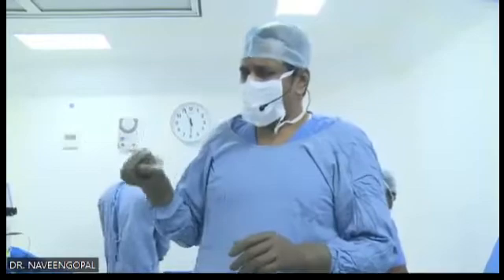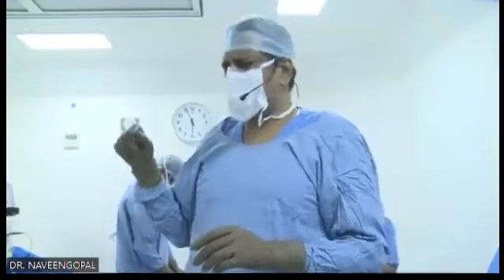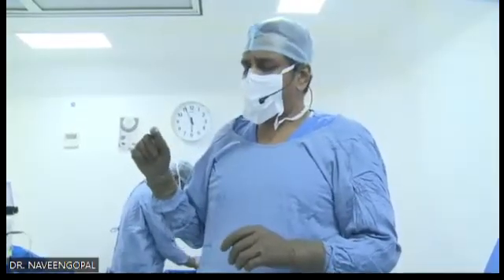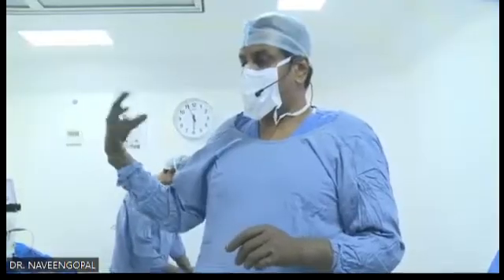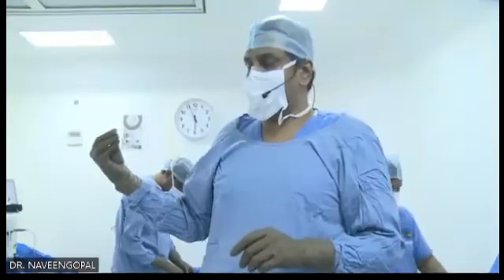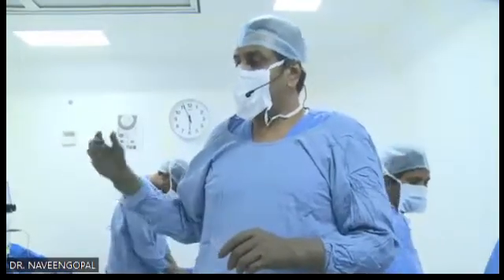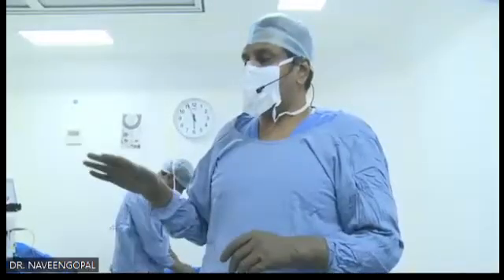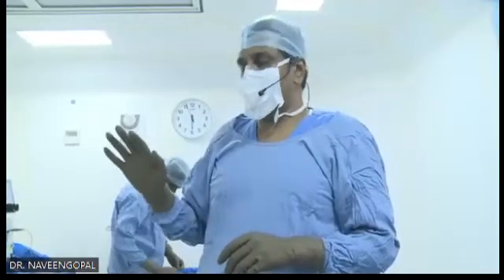And with the central hole, certain people, type A personality people, may complain of a small glare, especially during driving, wherever they see a headlight or things like that. But it will settle down. Reassure the patient. In 1 month or 2 months, it will settle down.